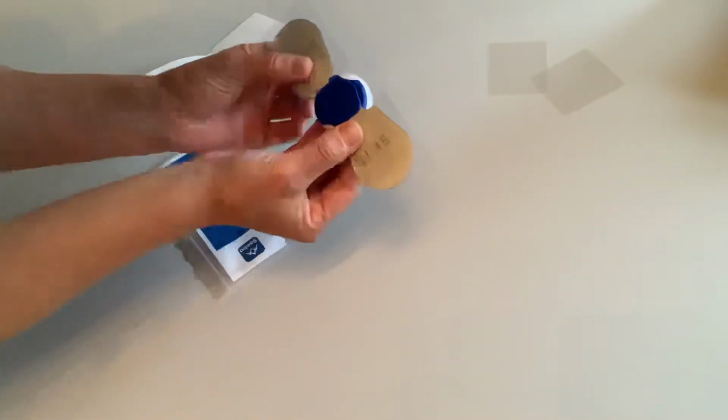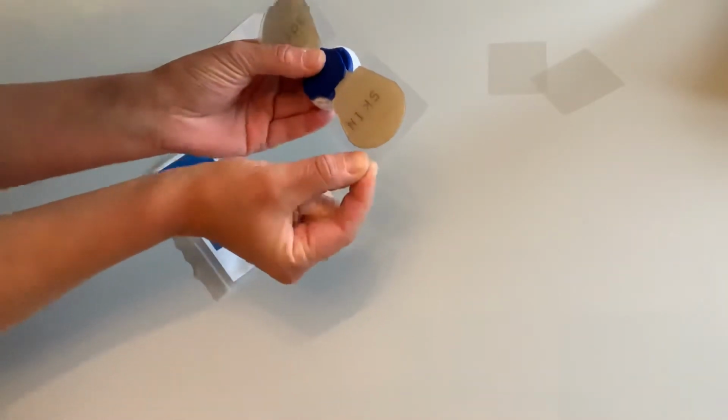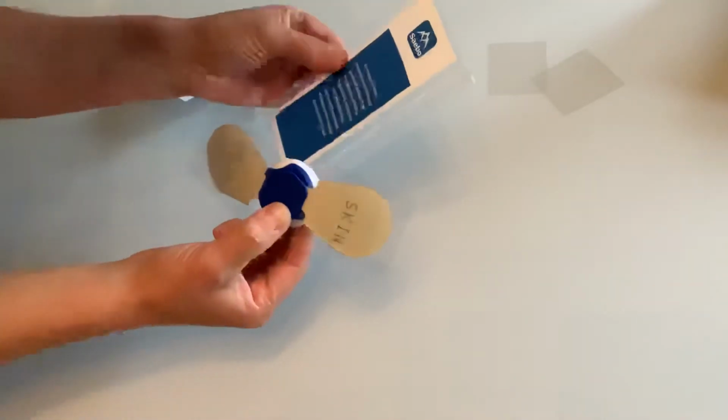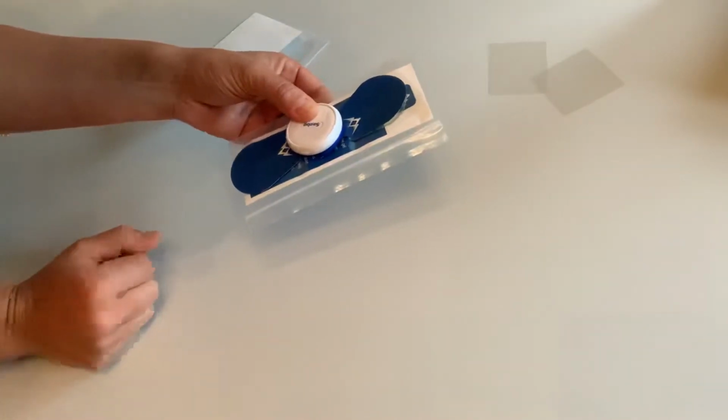Only when I'm going to use the device would I remove this final plastic cover, and then when the device is not in use, I will put this back on and then use this really helpful storage bag to prolong the life of the gel pads.